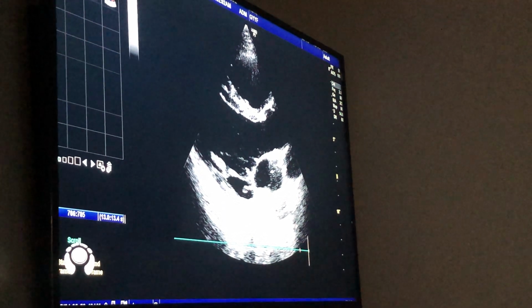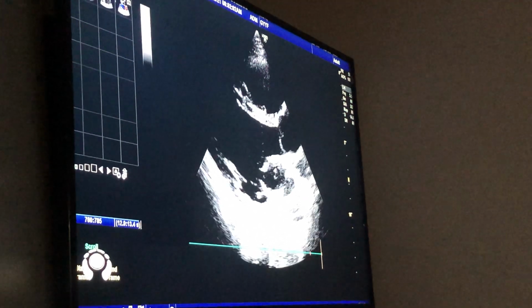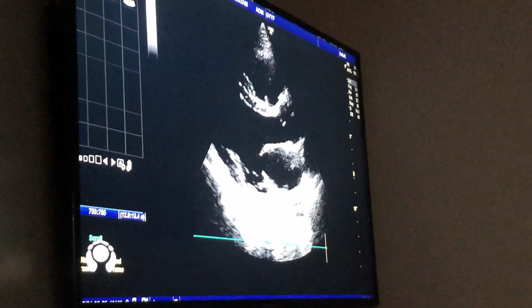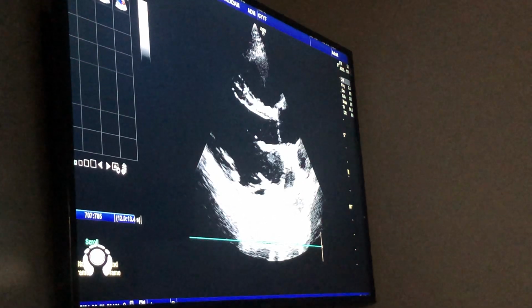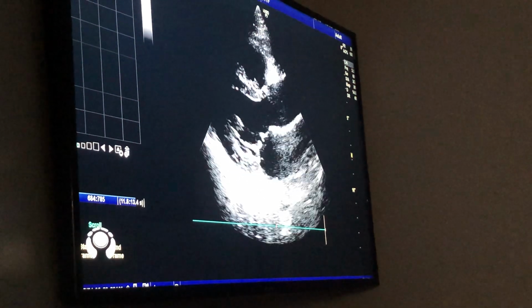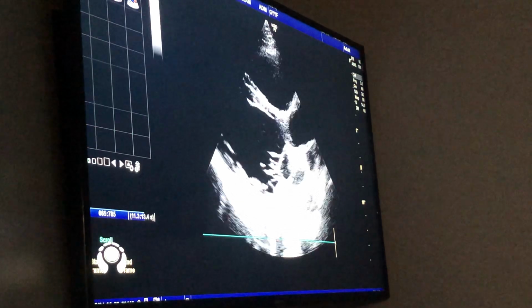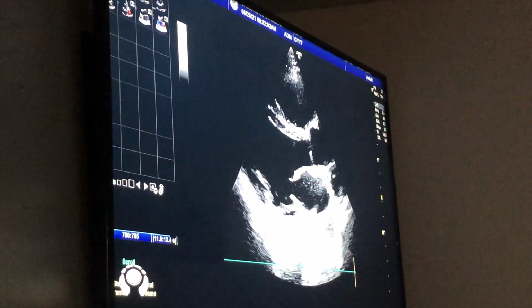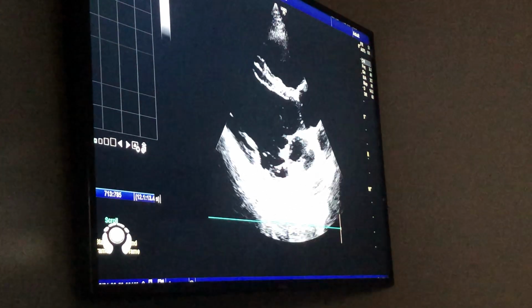So, if you don't have a working EKG, diastole, I'm gonna go back to 1B. Remember I told you guys we will talk about blood flow, right? I think I told you guys it was important to remember the Dr. Grimes situation, and you guys said she did talk about that, right? Yes. Okay, so we're gonna start.